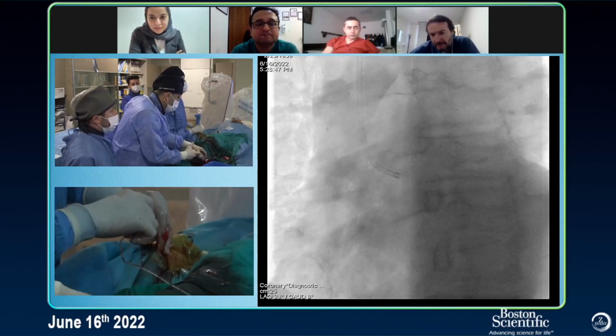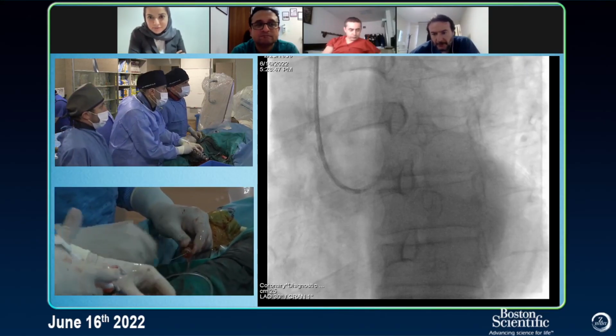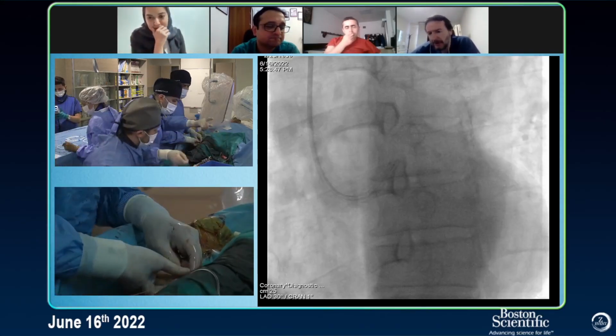So can you tell me the ACT, guys? How much is the ACT? ACT is important. I think it depends on what it looks like now. Test please. I think that the diagonal is open. I don't think it's going to be a problem.